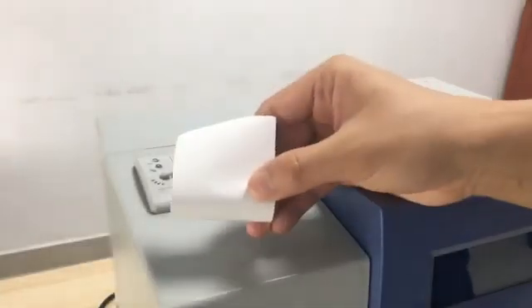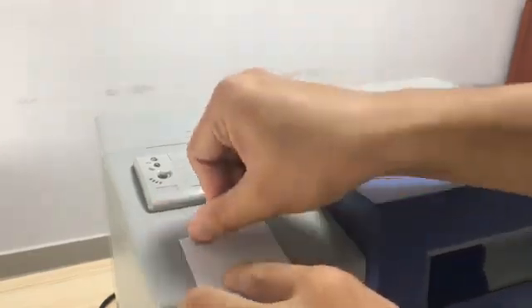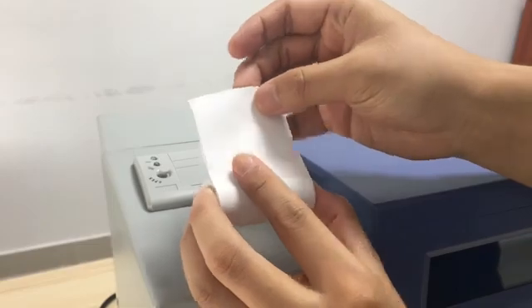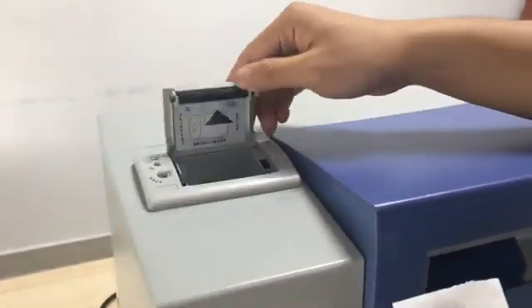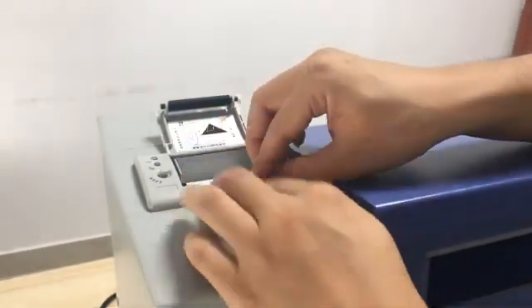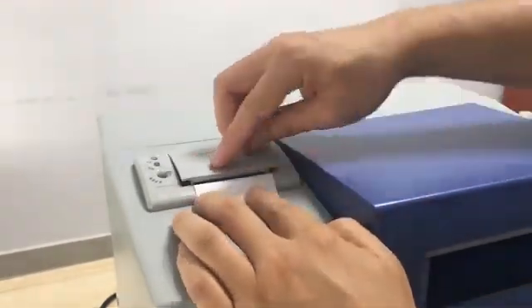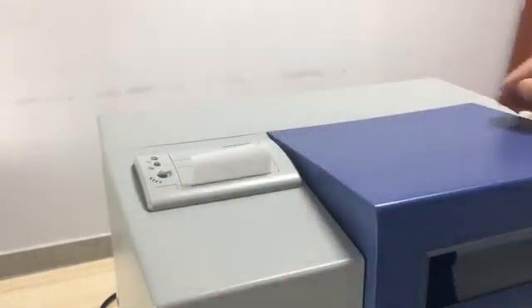We need to let the thermosensitive side face toward us. We can check by our nail — if there's black, it is this side. Then we open the printer and put it inside, pull a little bit, then close it. Printer paper installation is finished.